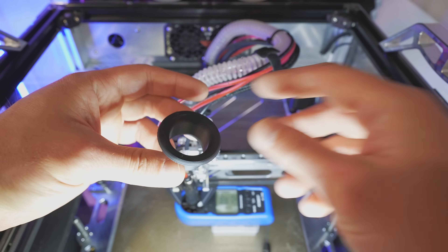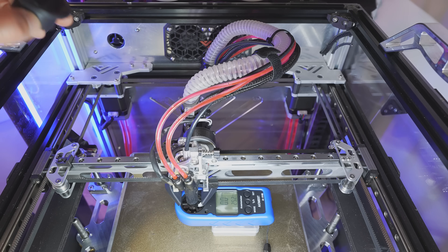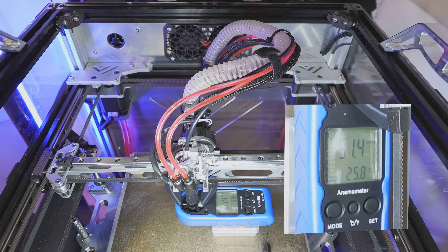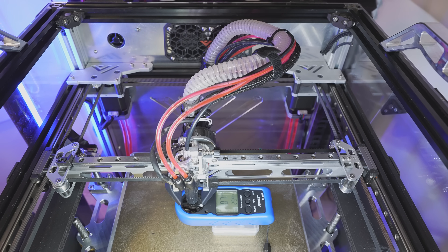Part is ready to go on and ready to test. We have our anemometer right there ready to measure the velocity. We're just going to launch the CPAP full blast and see if it affects the flow in any way. 51.4. There is absolutely no significant change in terms of velocity. Now let's just test the noise.